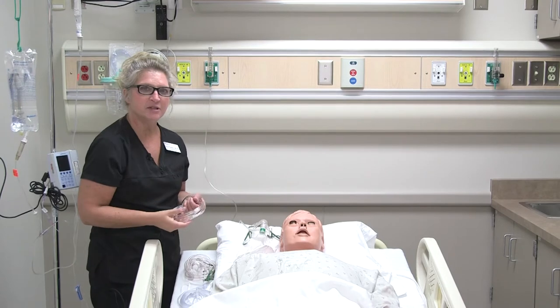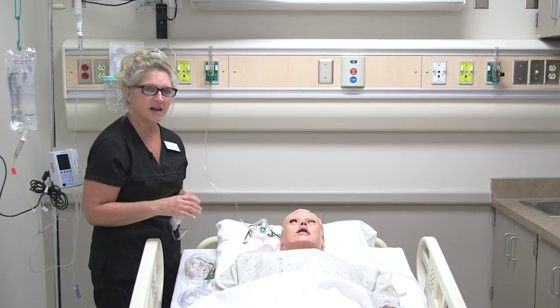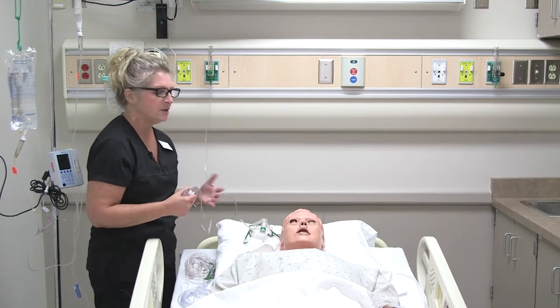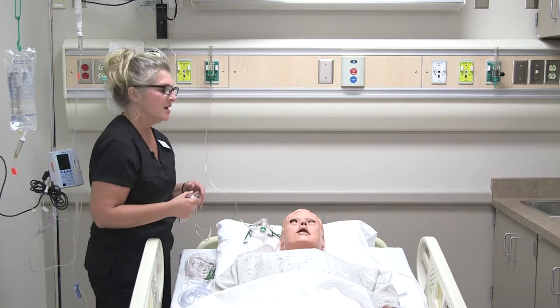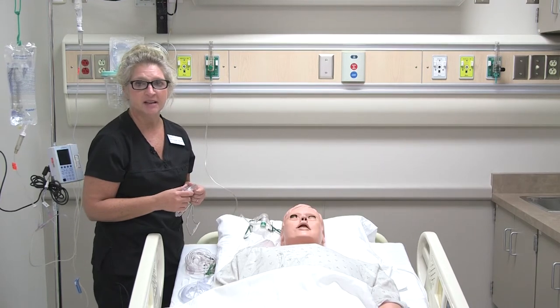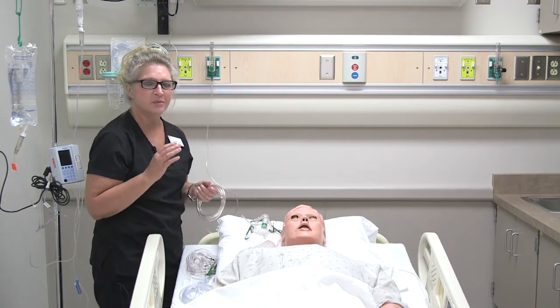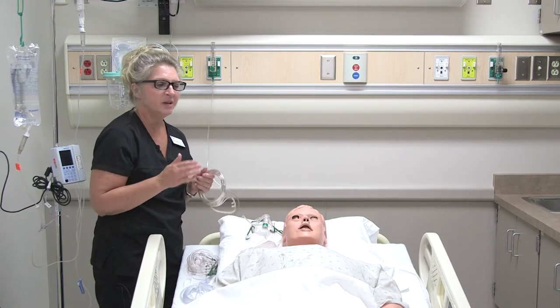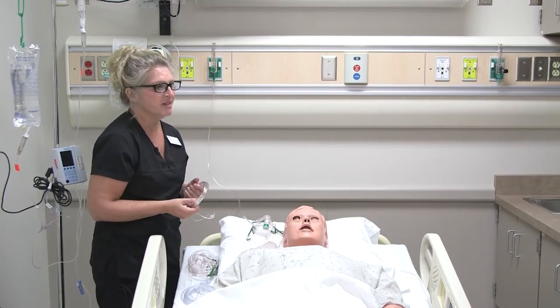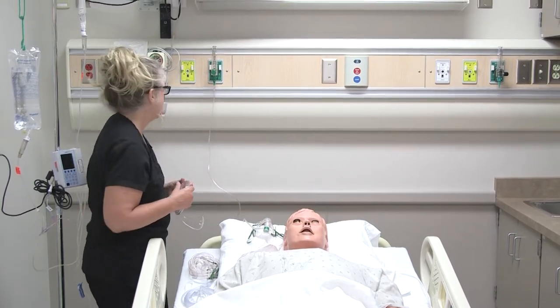So now I'm going to demonstrate just a few types of oxygen delivery systems and how to place them on the patient and what the near-standard is for oxygen flow levels. You will know that some resources may vary by one or two levels, but for the most part we're pretty close to what the standard is.